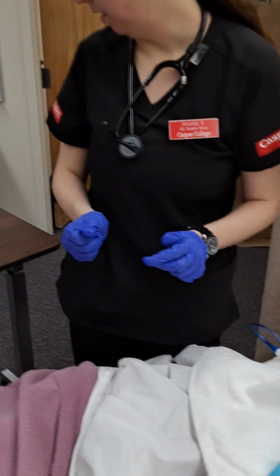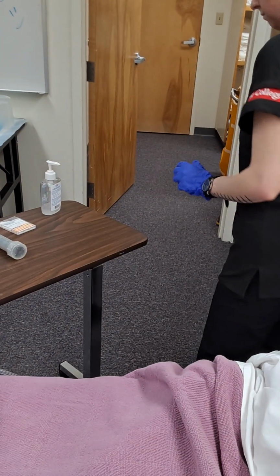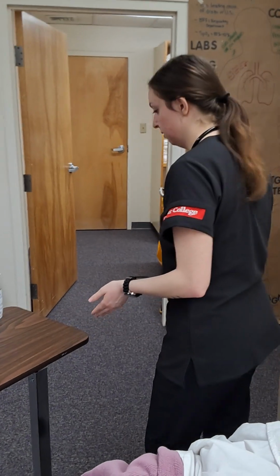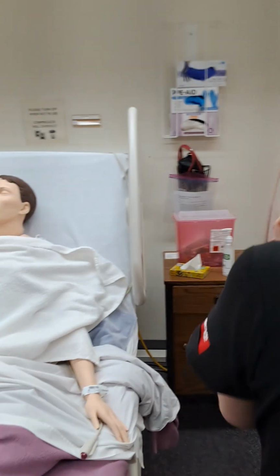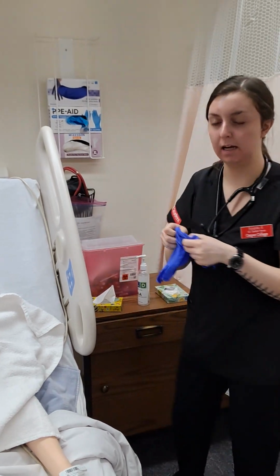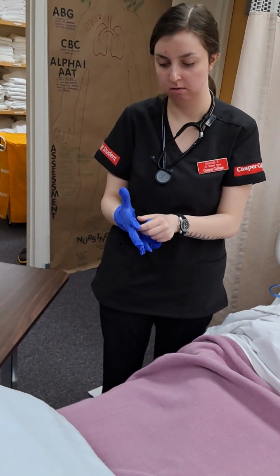Now I'm going to dispose of my equipment. I'm going to take off my gloves, sanitize my hands, and then this is when I will call for an x-ray. Now I'm going to put on some clean gloves and aspirate the GI contents and use a pH test strip to determine if we are in the stomach. But you'll also get an x-ray as well.